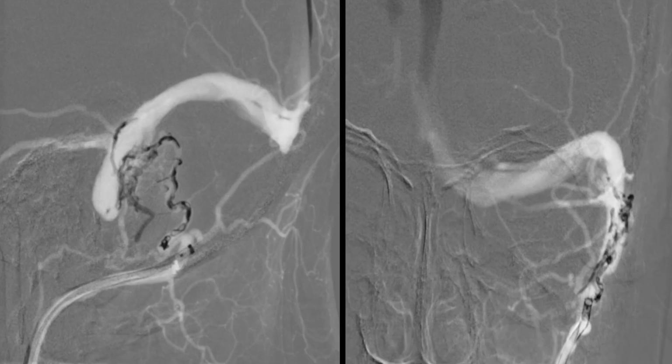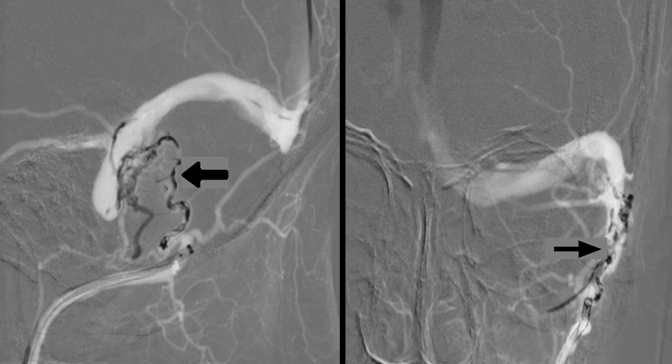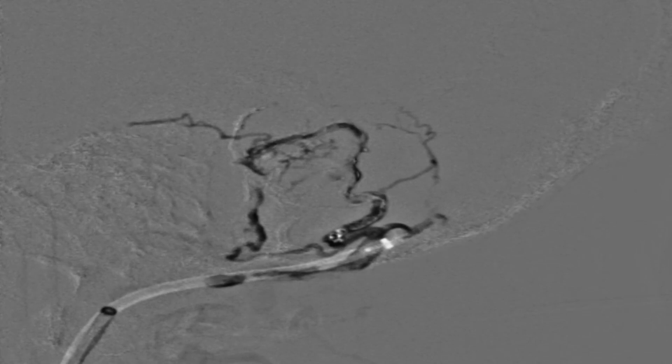After deploying the coils, we delivered liquid embolic agent into the feeder vessels and venous sinuses through the Apollo Onyx Delivery microcatheter. This is the AP and lateral view of the DSA showing injection of Onyx. This is the DSA showing the Onyx cast in the feeder vessels and the fistulous connection.